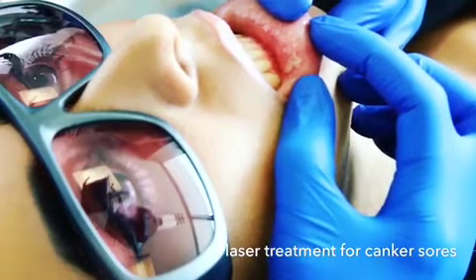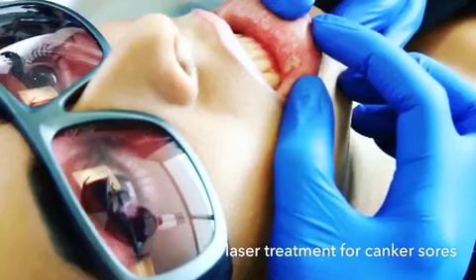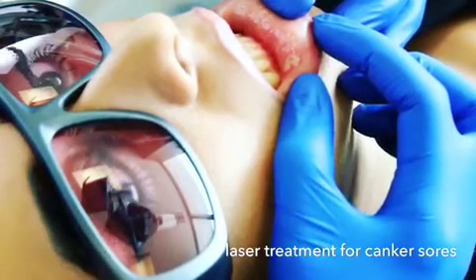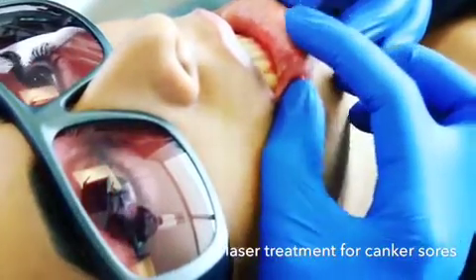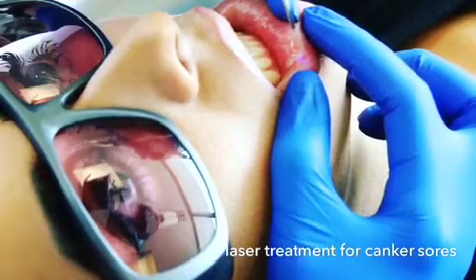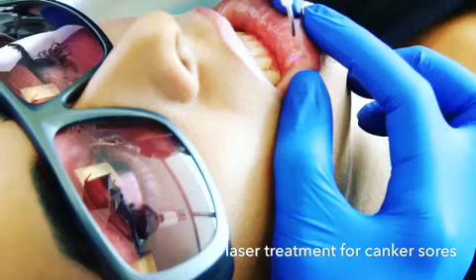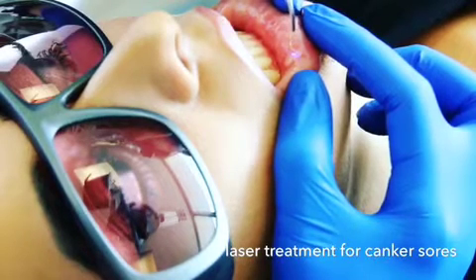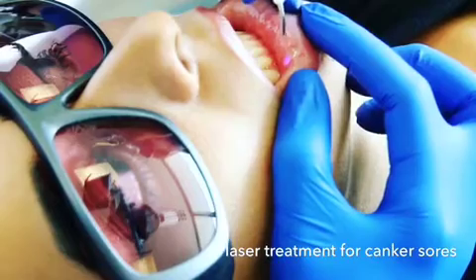Usually it takes about two weeks for an aphthous ulcer to heal, or you can do a laser treatment — the pain will subside after treatment and it will heal much faster. This treatment usually takes about 30 to 40 seconds, and then she will be pain-free. As you can see, she's not experiencing any pain; it's just a gentle hovering of the laser light over her lip.